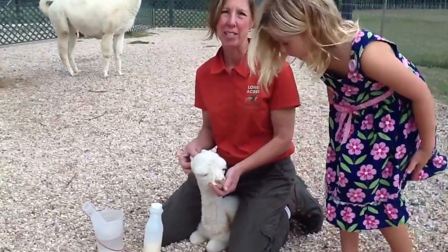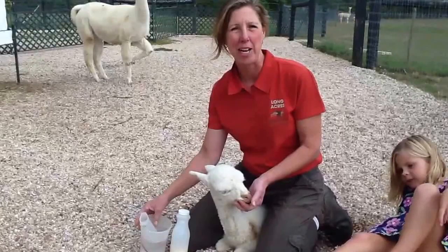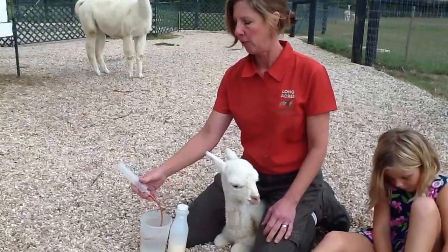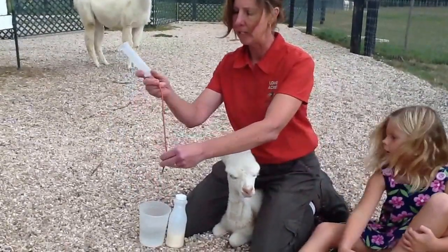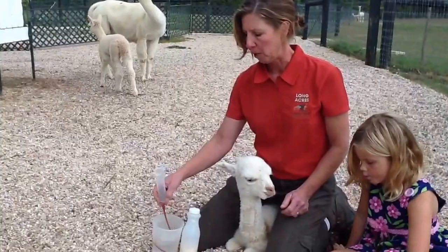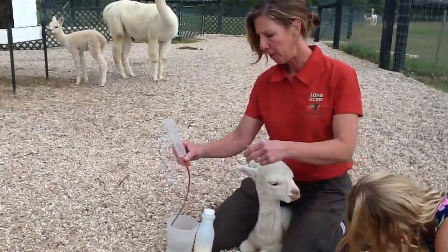So this guy's seasoned. He's had a feeding tube quite a bit, and one nice thing is after a while, they actually start swallowing the feeding tube. So this is my feeding tube — I believe it's a 14 French feeding tube — and I put it in hot water, and that's to make it nice and soft and limp. One of the bigger risks is you can puncture the esophagus, especially with a harder tube. So it's in nice hot water, and that makes it nice and limp.